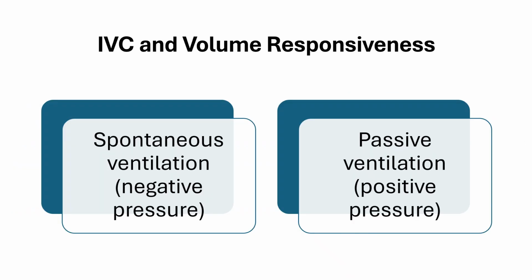When assessing the role of inferior vena cava ultrasonography in determining which patients are volume responsive or not, it is essential to keep in mind that spontaneous or negative pressure ventilation and positive pressure mechanical ventilation represent completely different physiologies. It is important for us to review it here, since this will be a foundation to understanding more advanced topics in the future.